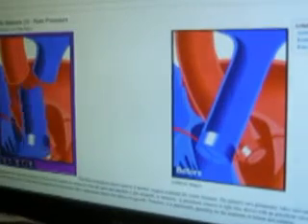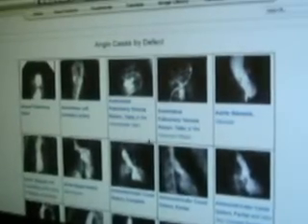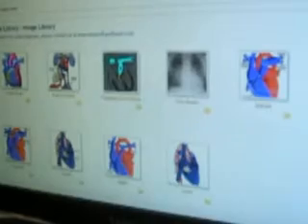The resource web also comes with some tutorials and some libraries. There's over 1,000 different angiograms and chest x-rays here, and we can show, for instance, the angiogram of someone with Marfan syndrome, and we can play this loop, and you can see this is a very dilated aneurysmal aortic root. We have handouts for all different types of congenital heart disease. These are available in different languages. We also talk about, again, treatments with the handouts.